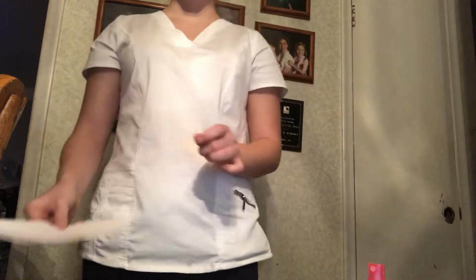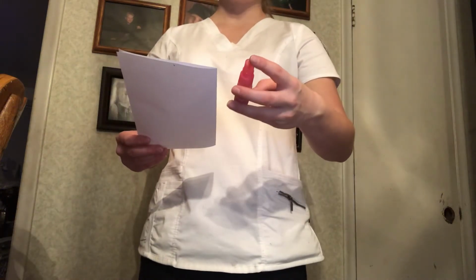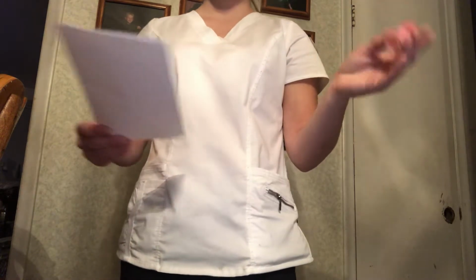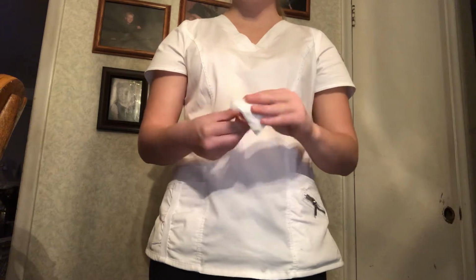So now that we've gone through all of that, I'm going to perform hand hygiene. I'm going to grab my medication from the Pyxis and check my vial. This is Lantus Glargine long-acting insulin for type 1 diabetes, and that is correct with the MAR. Now I'm going to take an alcohol swab and clean off the top of the vial.